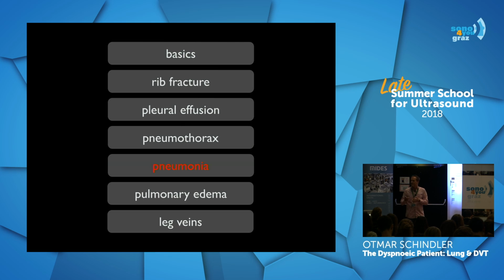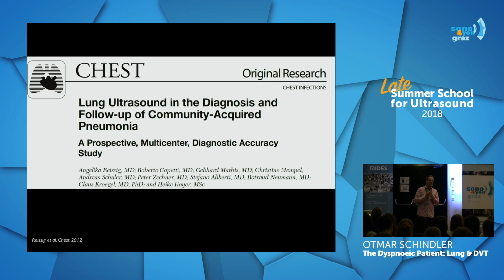Next thing to see, pneumonia. Is ultrasound useful for the detection of pneumonia? It is, yeah. There's been quite some good scientific work on it. What's the first thing you do if there's a patient coming to you during the winter time? He's coughing, he's febrile, he's breathing heavily. You're taking the ultrasound probe. Huh? What do you want to know?